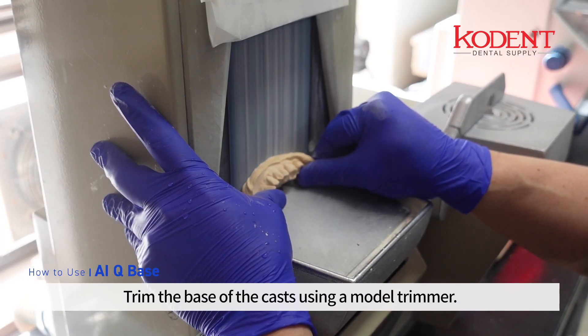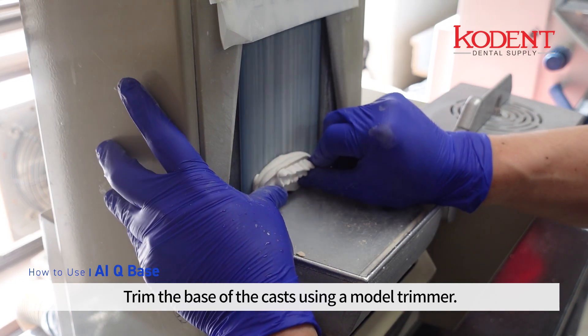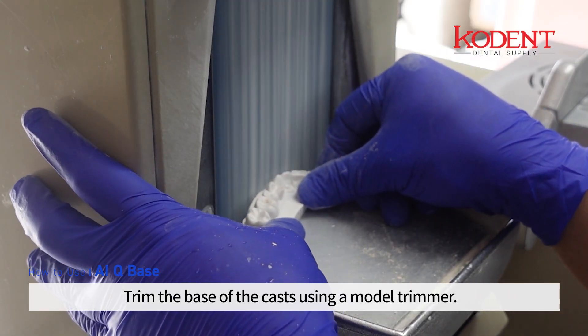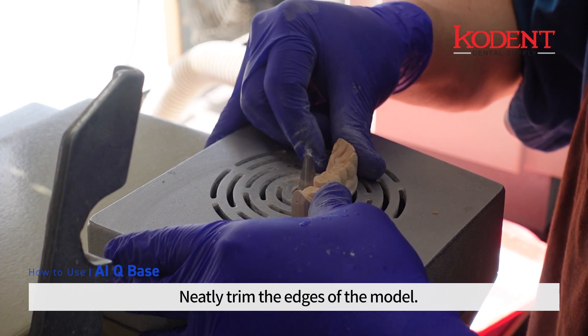Trim the base of the casts using a model trimmer, then neatly trim the edges of the model.